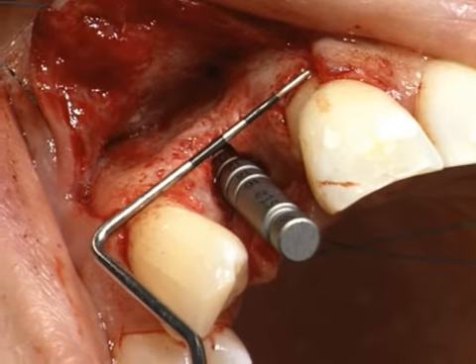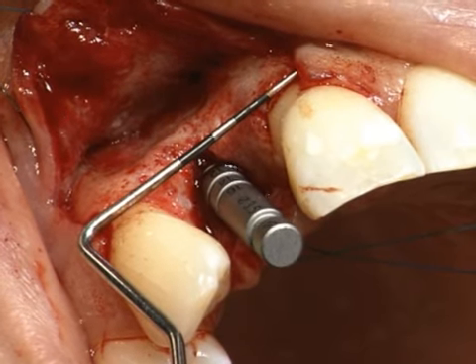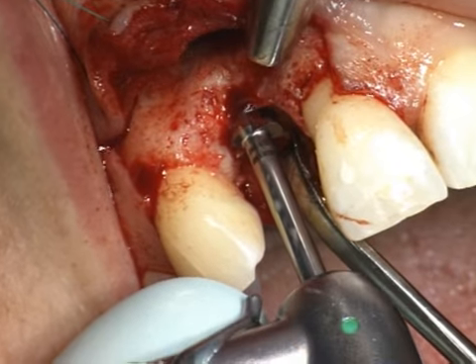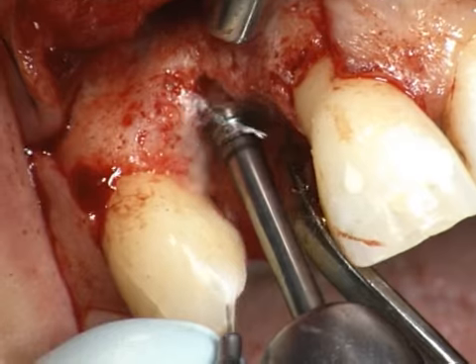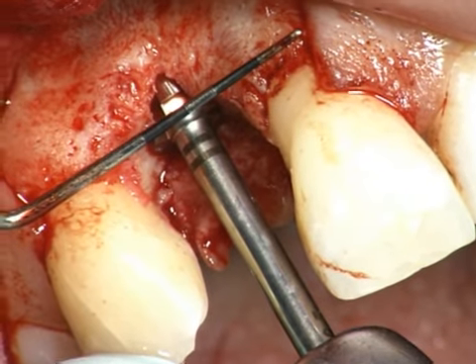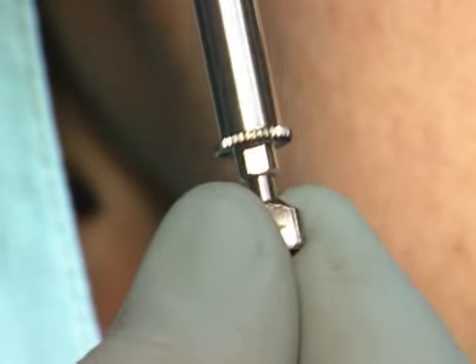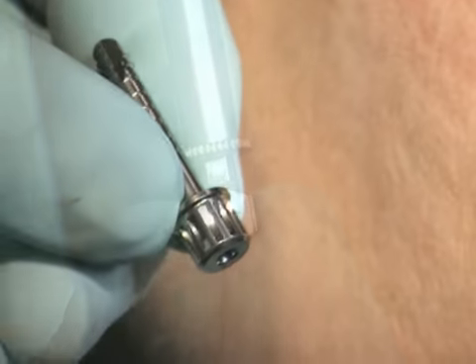The axis and the orofacial alignment permit the correct three-dimensional position of the implant. After the exact depth of drilling has been reached, the flared shape implant neck configuration is transferred to the bone with a 3.5 mm diameter profile drill at 400 rpm. At the same time, the vertical position of the implant is checked. The implant thread pattern is tapped in the bone with the 4.1 mm diameter tap.